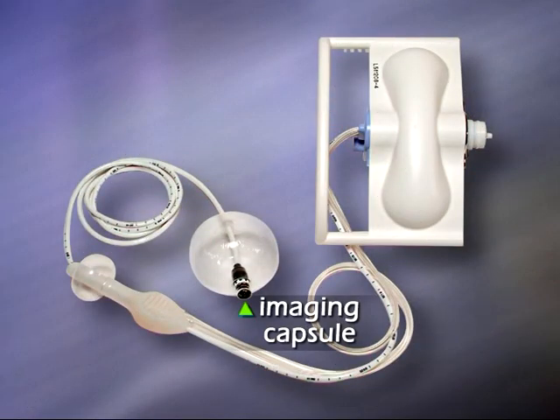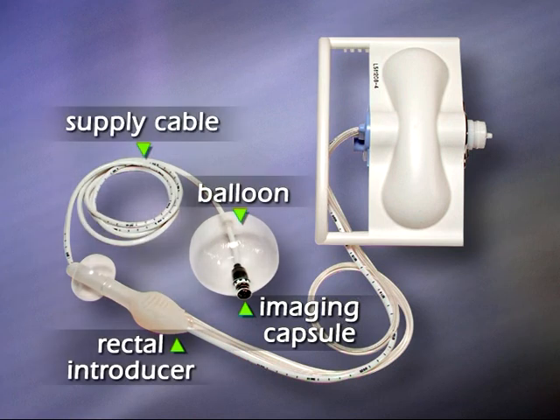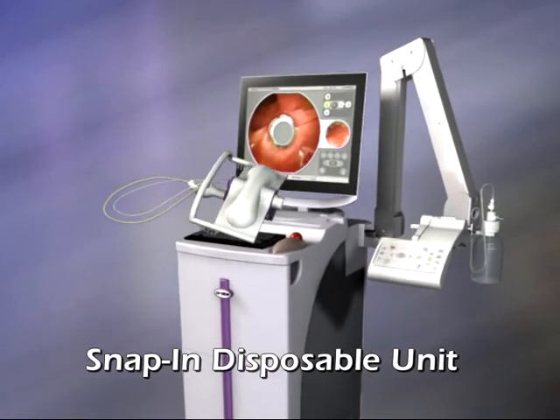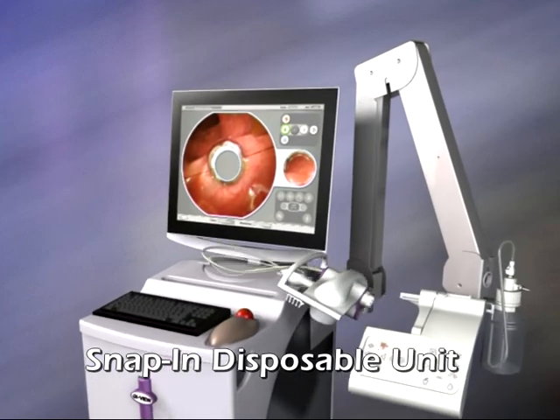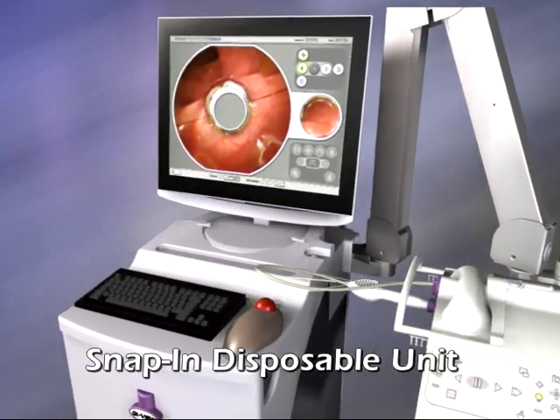The Aeroscope imaging capsule and balloon, the rectal introducer with a supply cable threaded through it and connected to the residual fluids container, form a snap-in disposable unit. The workstation arm enables easy positioning of the control panel by the patient bed.